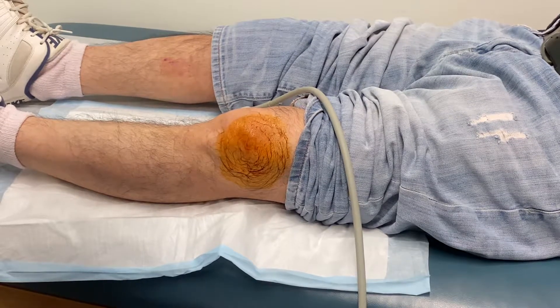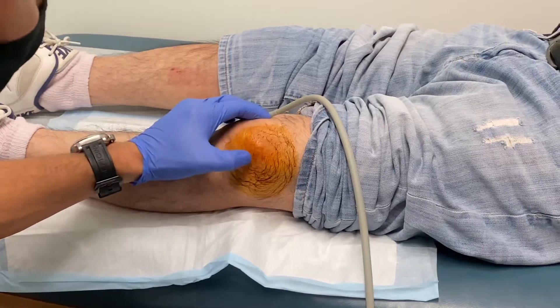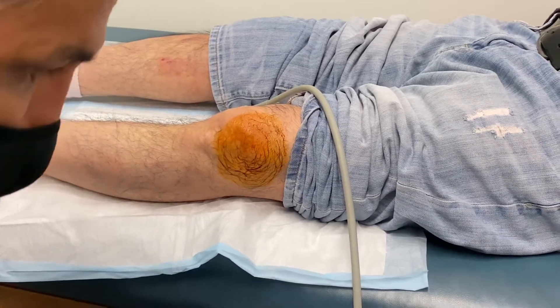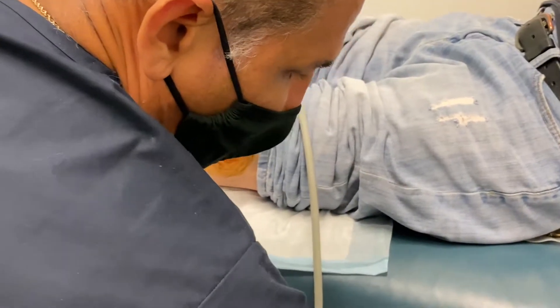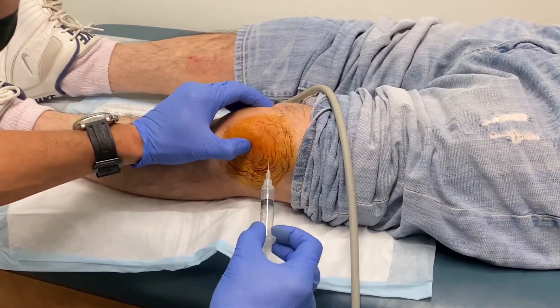So this is what I do to get things going. I already prepped it with alcohol and betadine. I made a circle. I felt my landmarks — there's my patella. This is actually where I'll be injecting. What I do is start with a 27-gauge needle and use that to inject 1% lidocaine into the target.